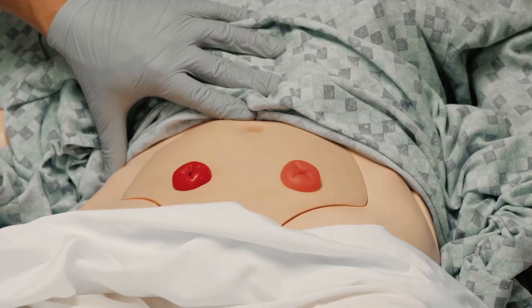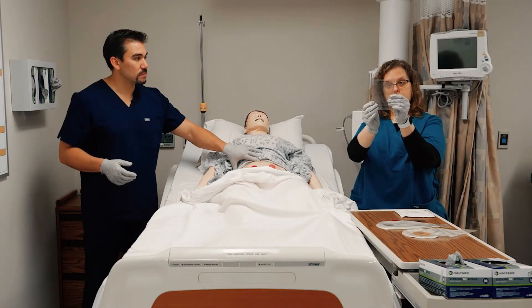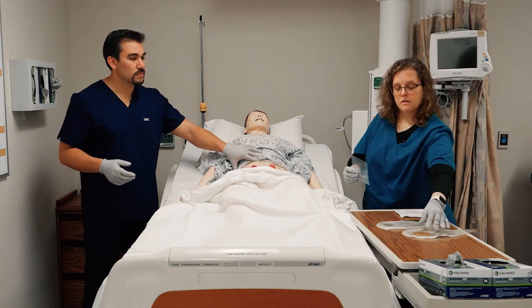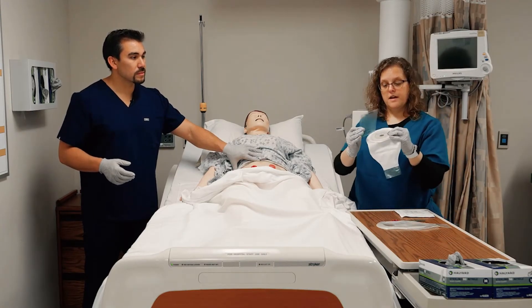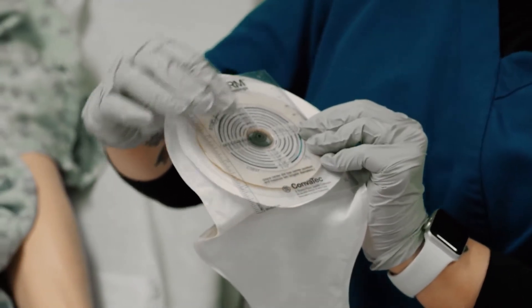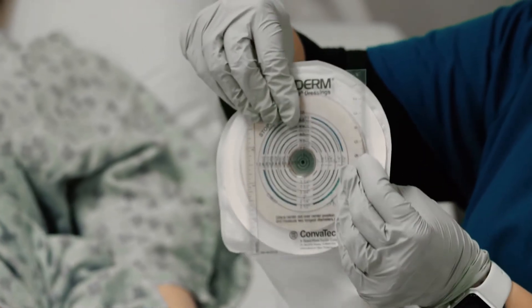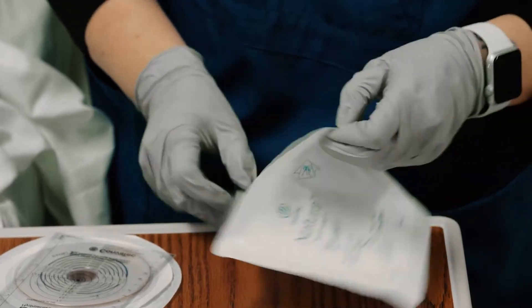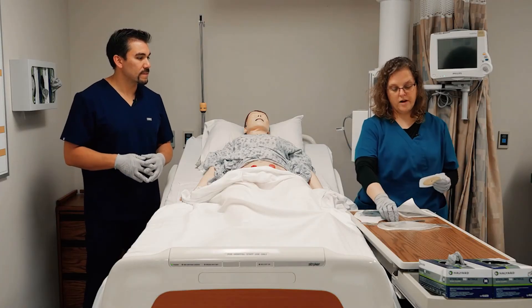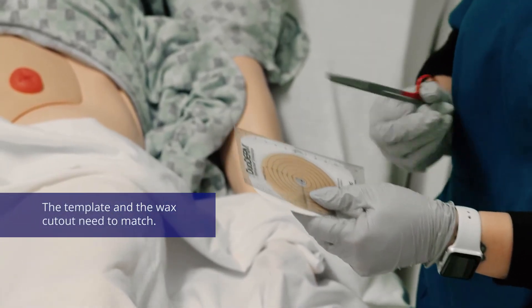I would say that's about four centimeters in diameter. If I was going to match it up to the other tool, I'd line it up and figure out where my four was — on this one, that's going to be about 38 millimeters. So I'm going to open the stand-alone wafer, cut this piece out, and then you have a template.